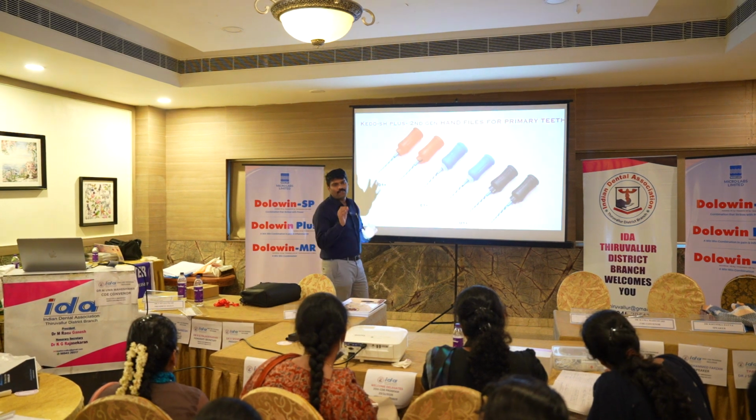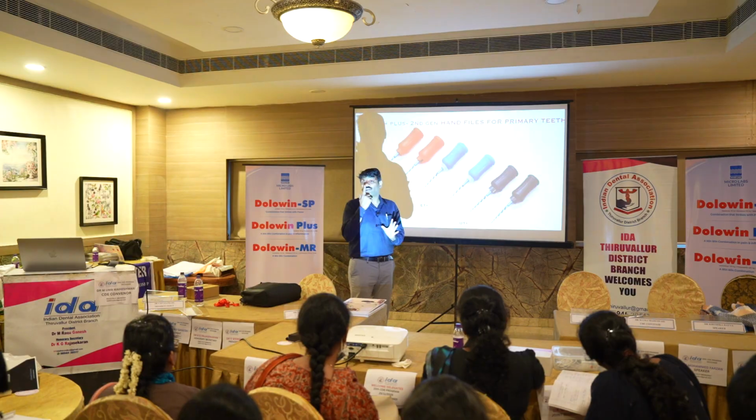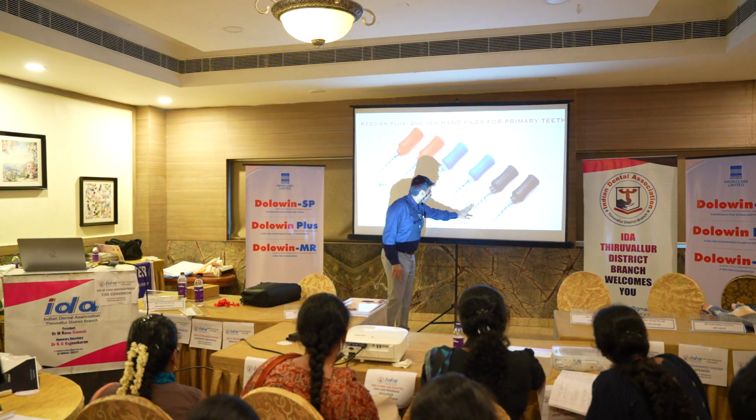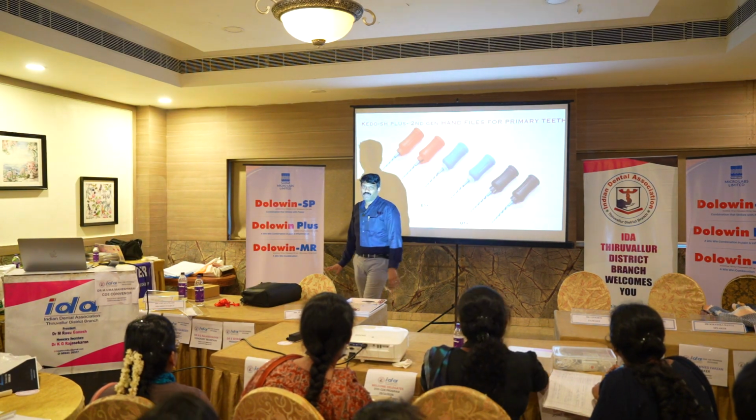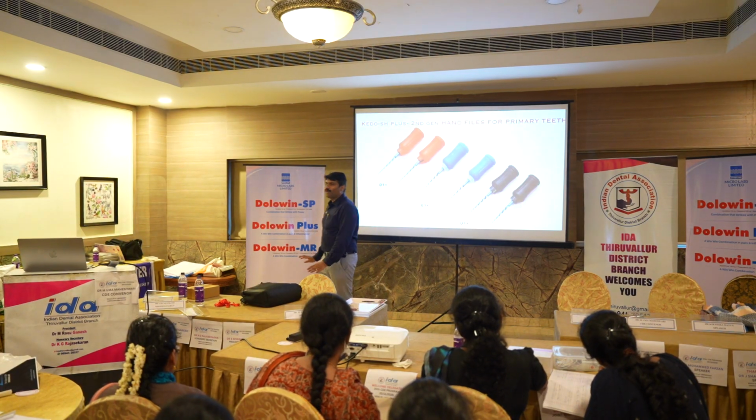K file which you will have to use for the first time. Done for the anterior, followed by only this black file. Done. So 20 anteriors you can do. You want me to repeat the sequence?